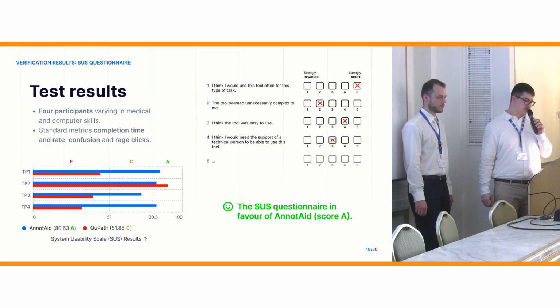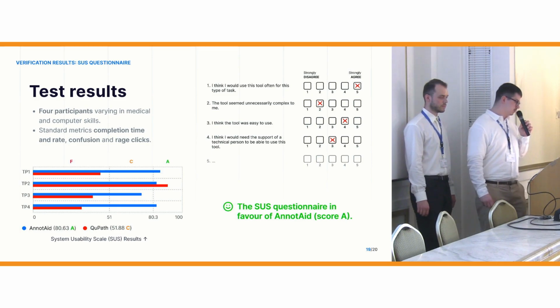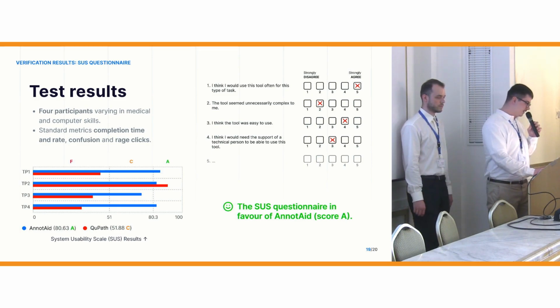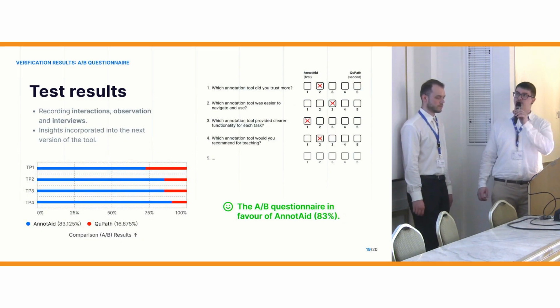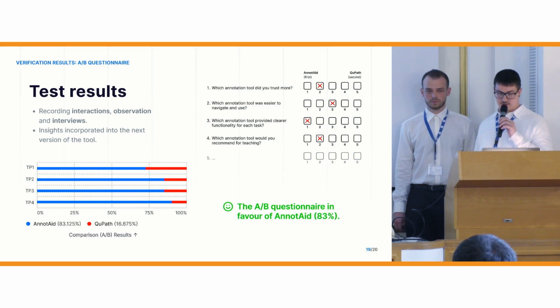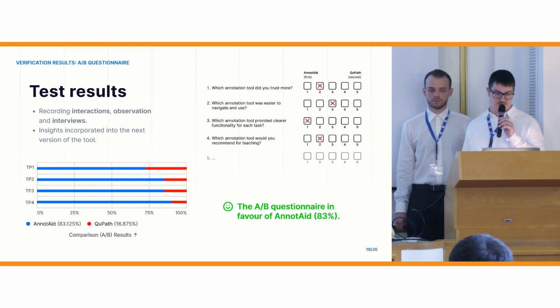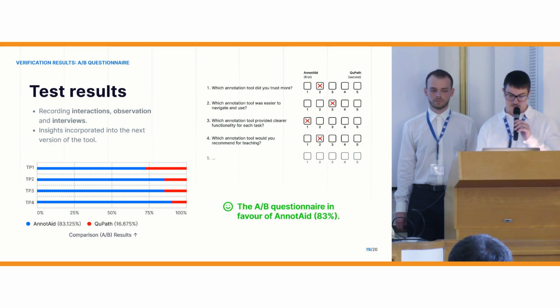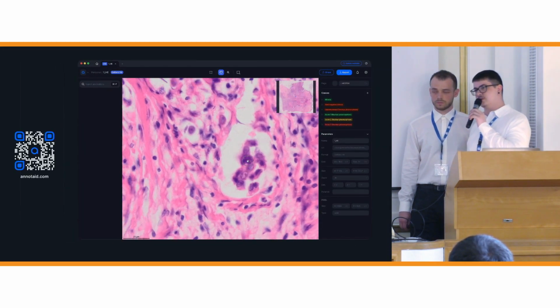The results leaned towards our tool with the grade of A, while the other tool received the grade of C. Another questionnaire was devoted to comparing tools for different questions, where we can see that 83% of respondents prefer our tool more than QPath. Thank you for coming, and if you have any questions, feel free to ask.